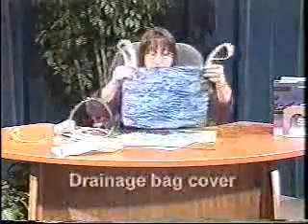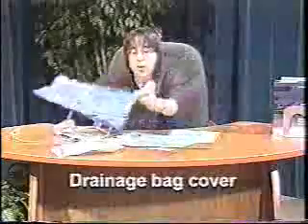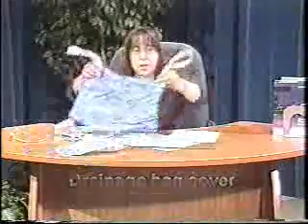In order to provide dignity and privacy for the resident, we will also use a catheter cover bag, and this bag will cover the drainage bag. It will be applied when the resident is at the bedside or in their wheelchair, or when they're walking, perhaps with the walker. Sometimes they will be applied to the walker.